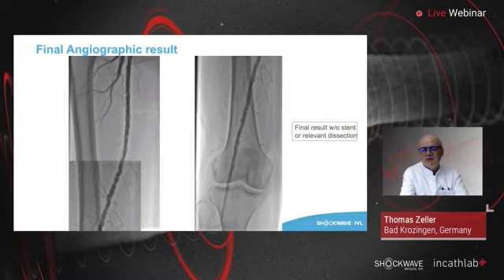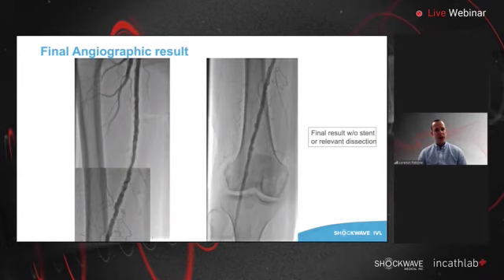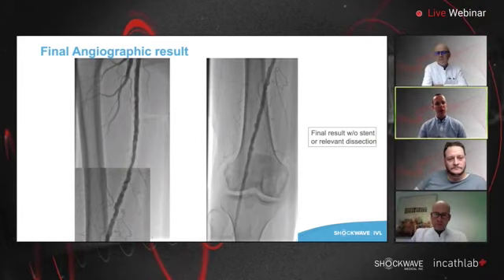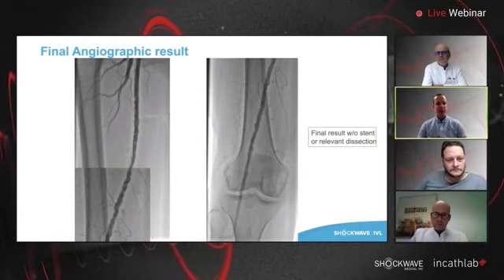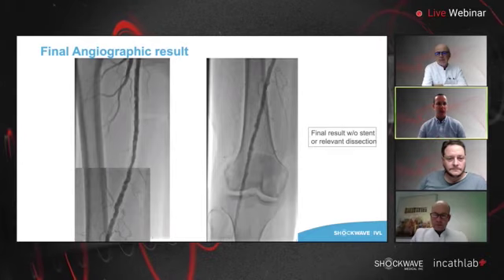What's your view? Definitely, I think it looks very nice. And I would like to ask you a very specific question. Can you talk about the sizing of the balloon? Because you mentioned that in your presentation. So does the balloon need to be sized 1-to-1, or even a bit more? Can you tell us your experience?